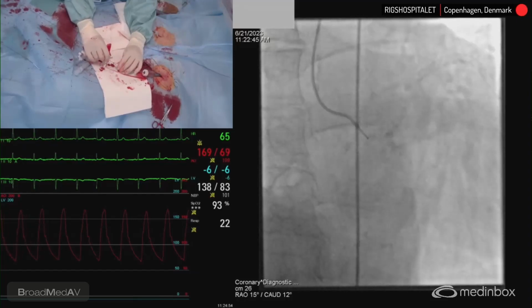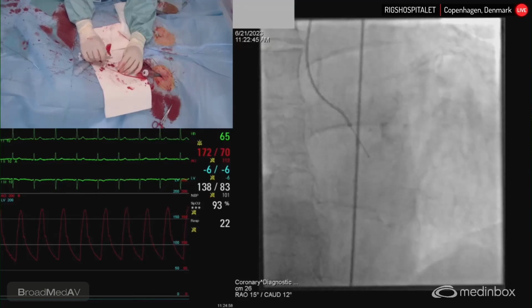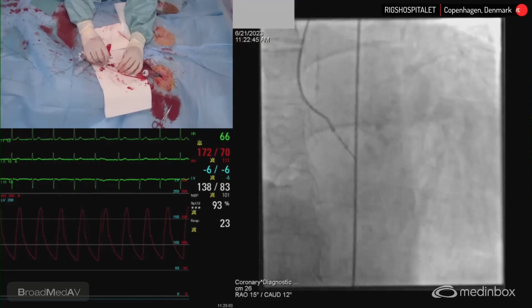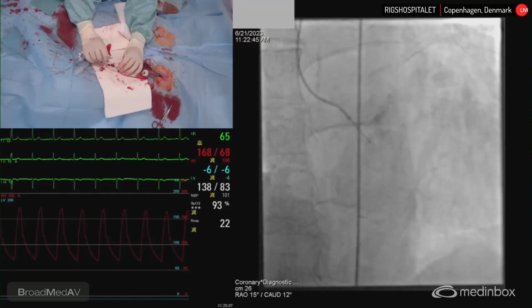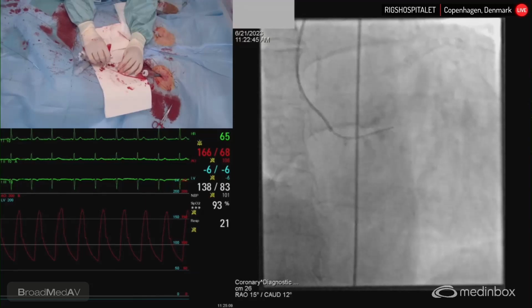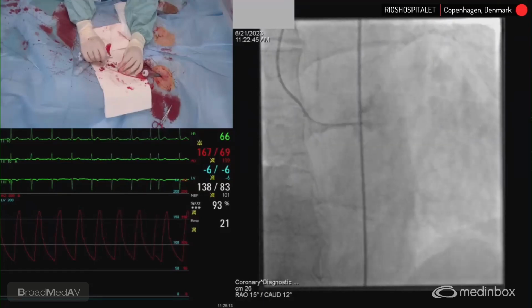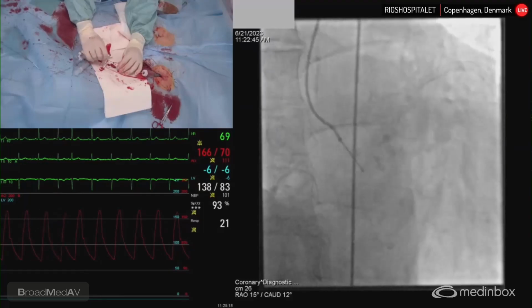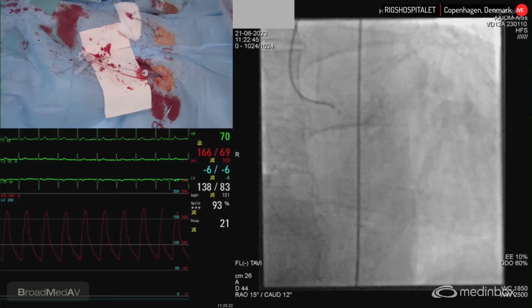Okay, then we can give maybe 1,005. No, that's the same spot as we were before, just in the middle there. Yeah, there, around. Okay, otherwise you bring in the pigtail, and that could help you to get some more orientation. I don't think it helps typically, but do it.